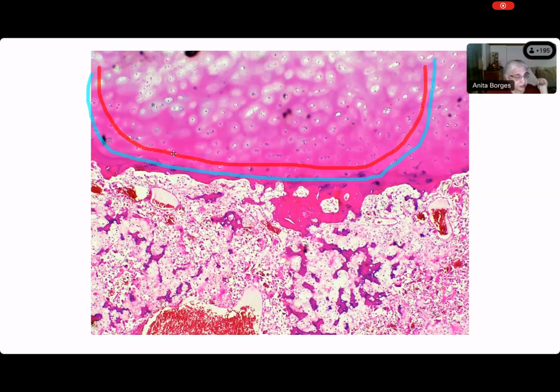It's fine. You don't think that this is part of the tumor. You think that this is part of what? What did you say, Mansi? Of cortical bone. Okay. Monica, what do you think? Is this or is this not part of the tumor? This is part of the bone.